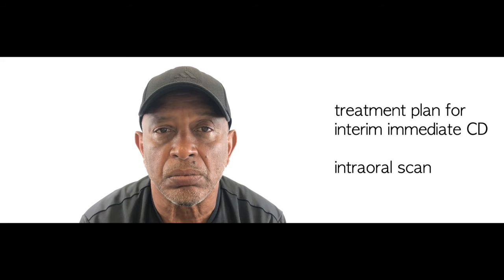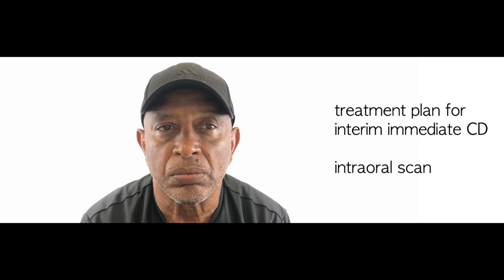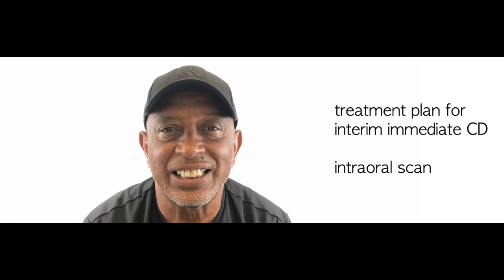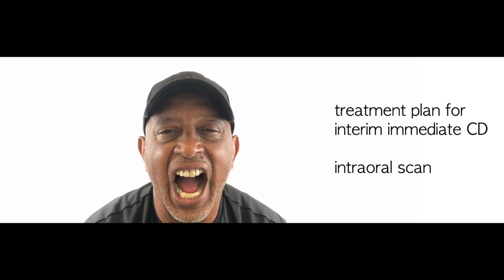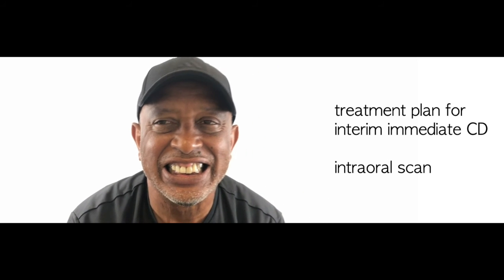So this particular patient, treatment plan for interim immediate complete denture. So we start with intraoral scanning. So still, as you see, the teeth that are planned for extraction are still there when you're scanning for the maxilla.